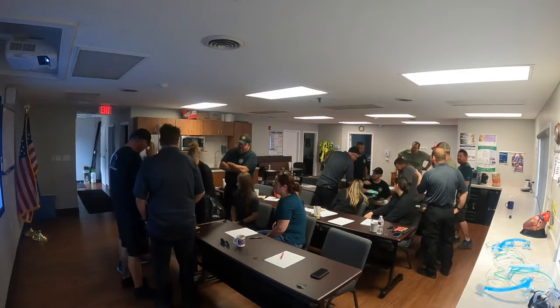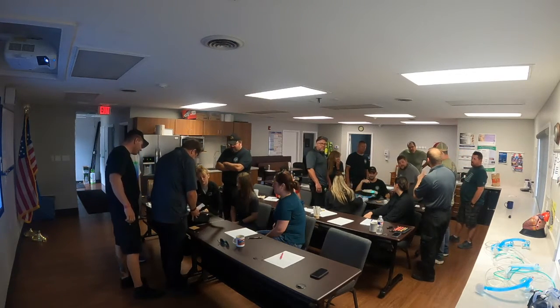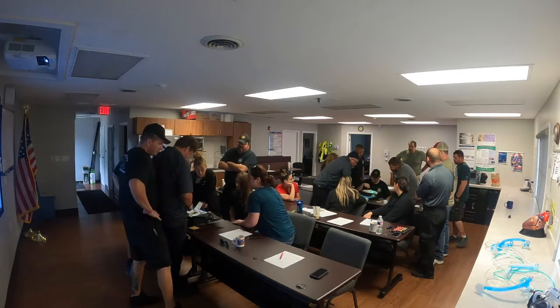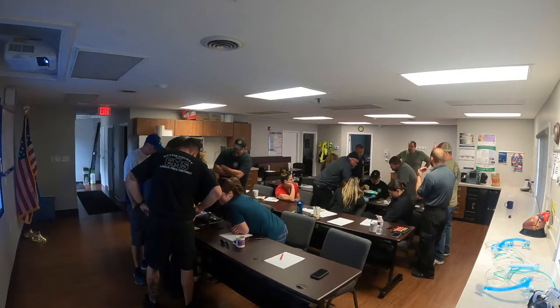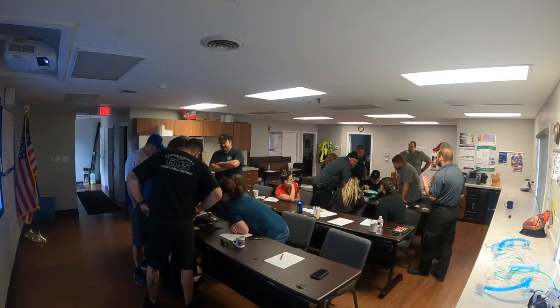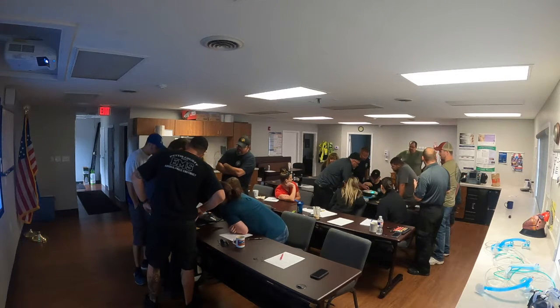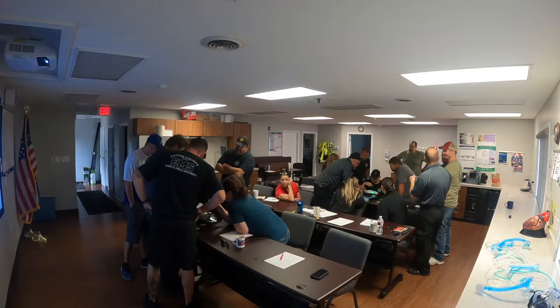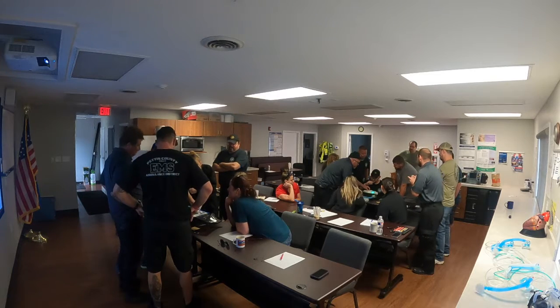So currently, as of right now, when you turn on your vent, you choose adult, pediatric, or CPAP. We always start with our adult, because that's generally what we're gonna be dealing with. The default setting should be AC volume, with a volume setting of 500 or 450, and a respiratory rate of about 14. If you choose adult, set the 450. If not, it will be the last mode.